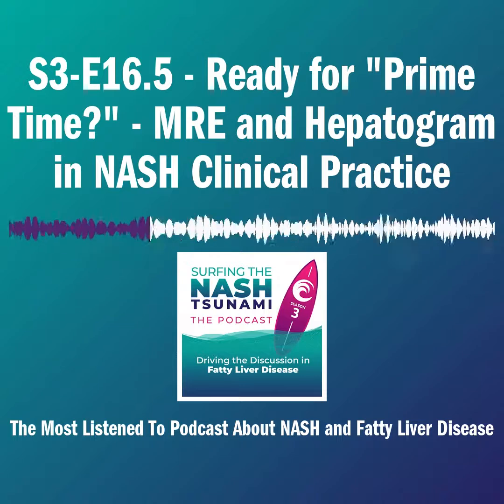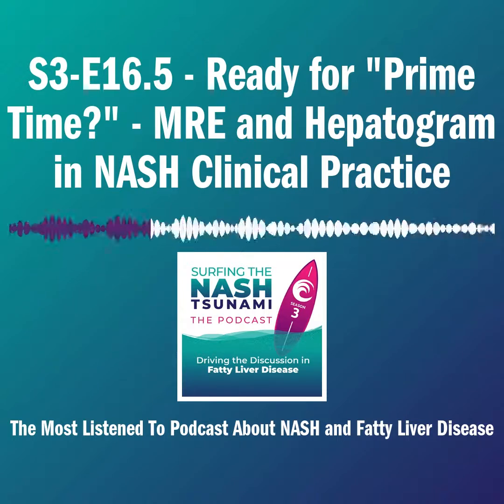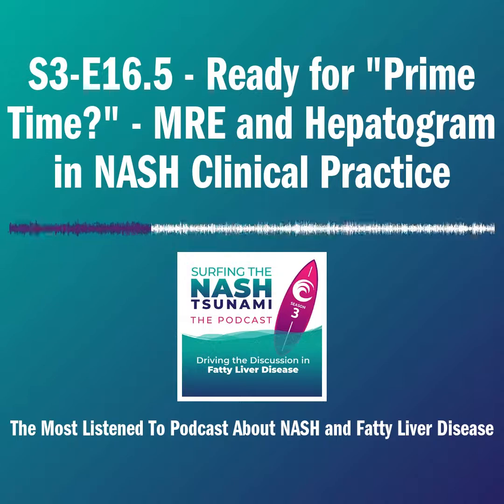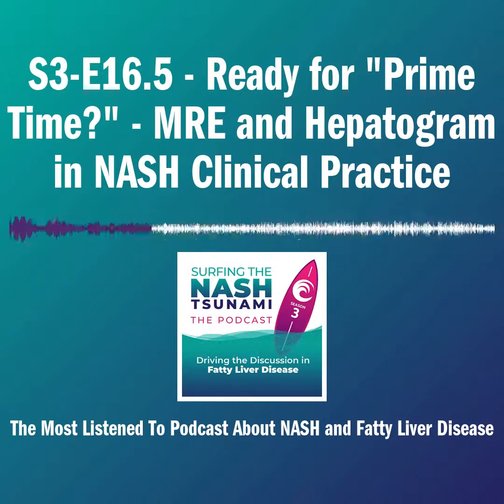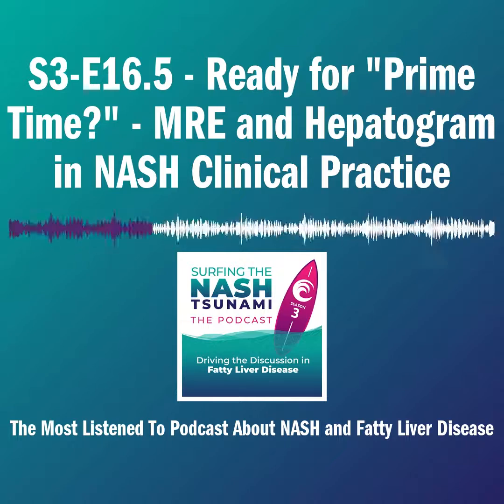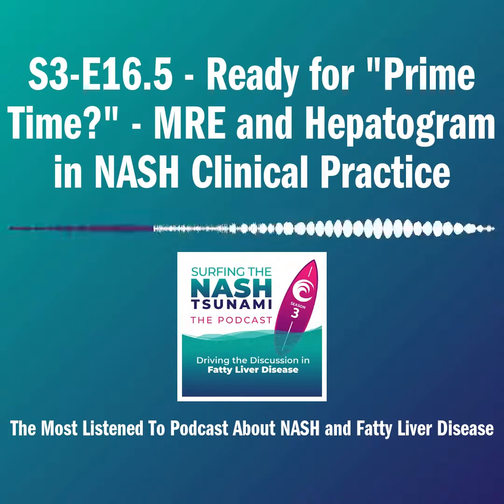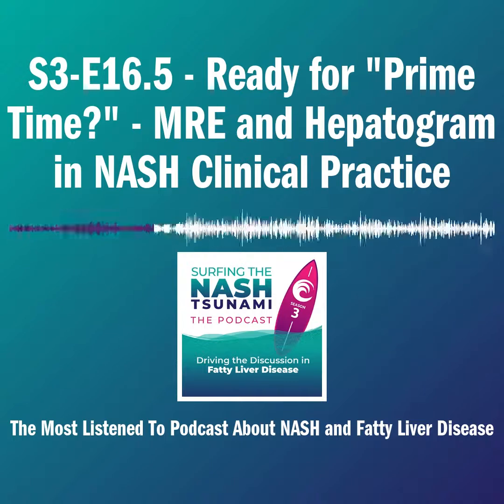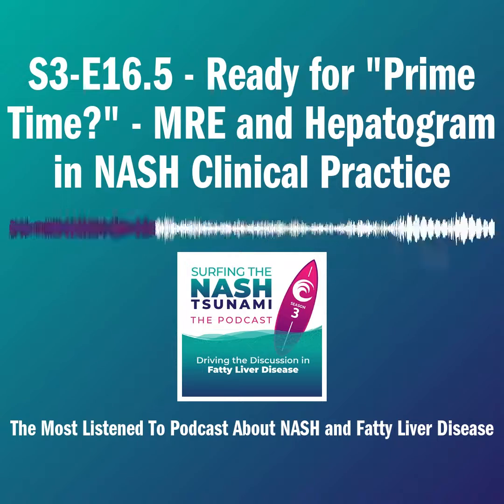Just briefly, for those of you who are not familiar with MRE, it's very similar to MRI. The main difference is that it does require a driver device that is essentially a plastic paddle placed in the right upper quadrant, secured with a neoprene wrap, and connected by a tube that goes outside of the magnet to essentially a subwoofer that puts in vibrations at about 60 hertz. So it sort of jiggles your right upper quadrant. I've had that done myself several times. It's really not that uncomfortable, and the machine just gives a gentle vibration to the rib cage, which transmits shear waves into the liver.